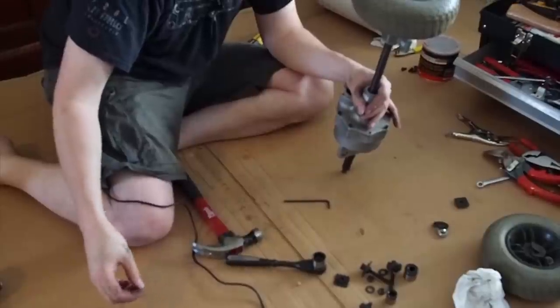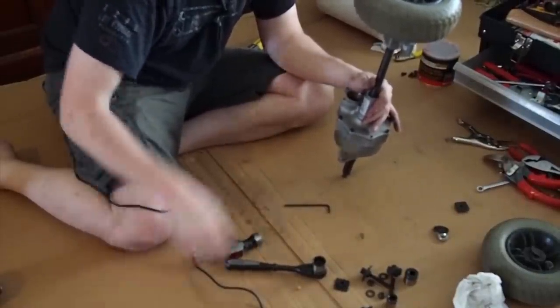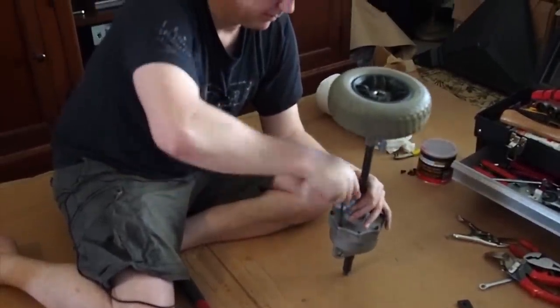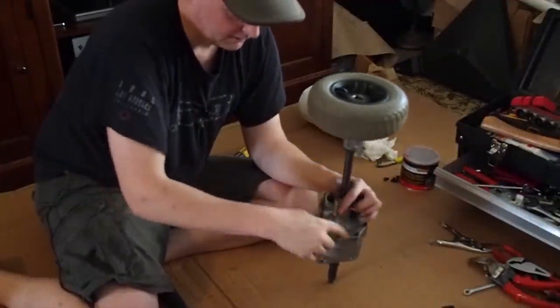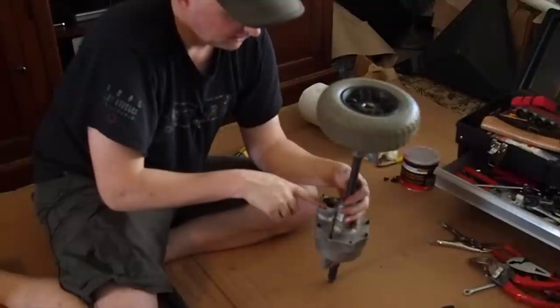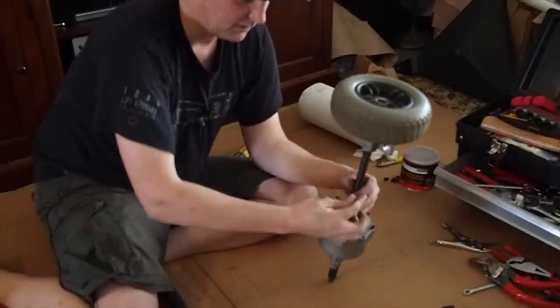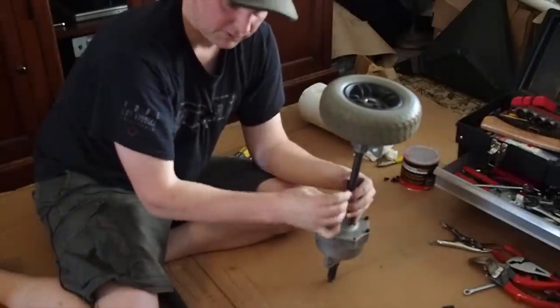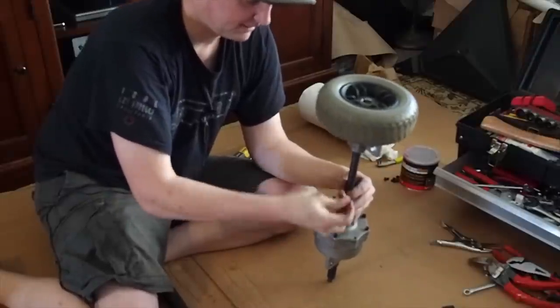In terms of size, I think the motor bolts are different sizes than the rest, so I don't think I'm going to have a problem remembering which go where. I think these are all the same size, and then these two are the same size, and then this one is the smallest one. So for the transaxle, finding out which bolts go where is not a big problem.